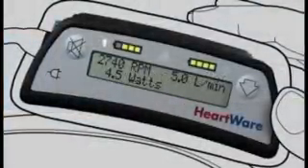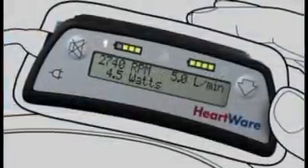The HeartWare controller operates the pump and makes sure that it is working correctly. The display on the controller provides you with information about the pump performance that includes the blood flow, the speed, and the amount of power being used.